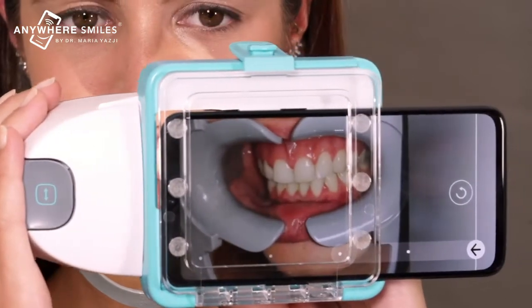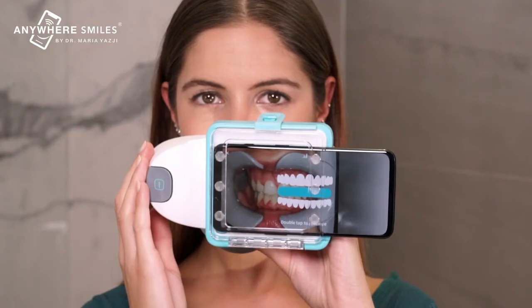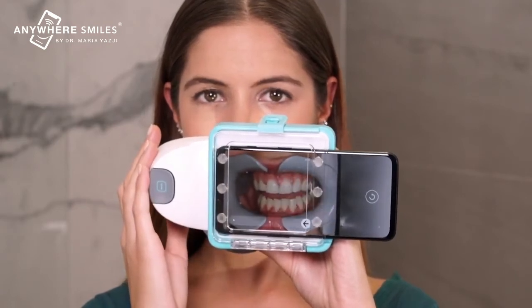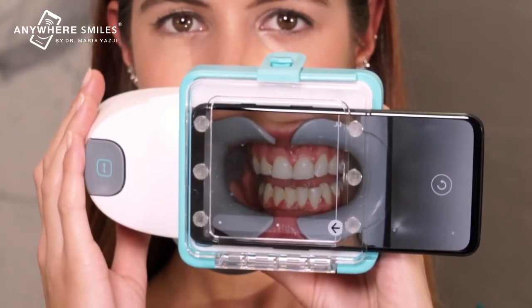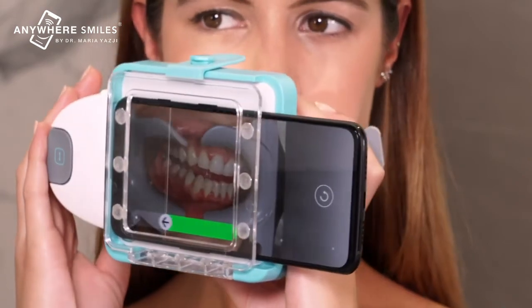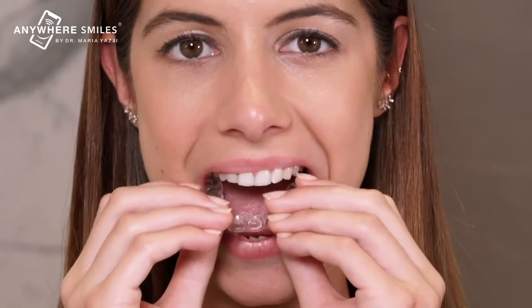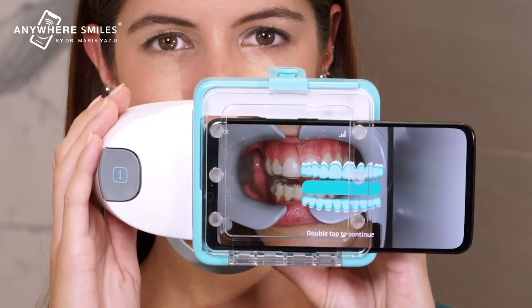If you need to restart the current step, simply press the Restart button. For this next step, you'll have to keep your teeth slightly apart and scan side to side. Open your mouth just enough for your tongue to fit in between your teeth. For this next step, insert your aligners. Open your mouth slightly and keep your teeth apart.